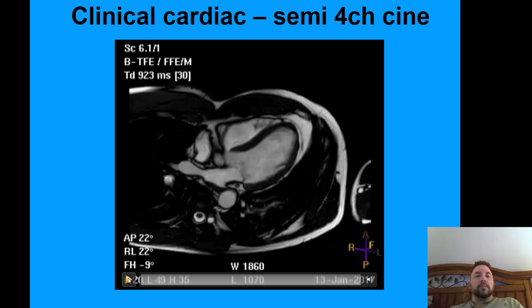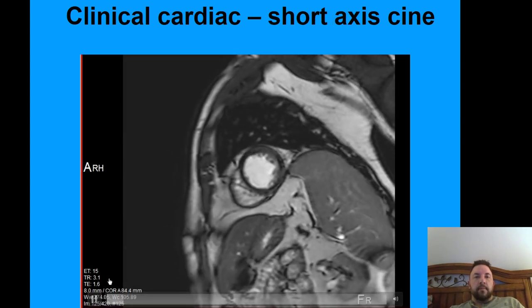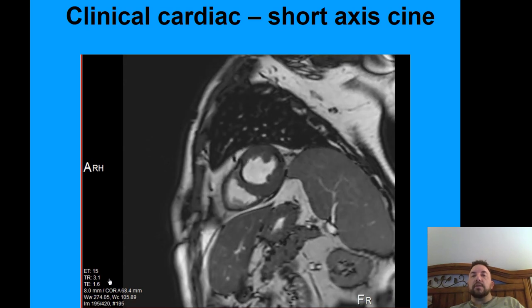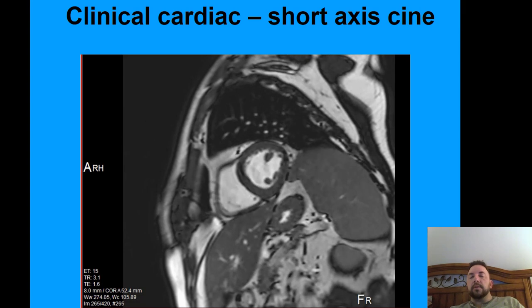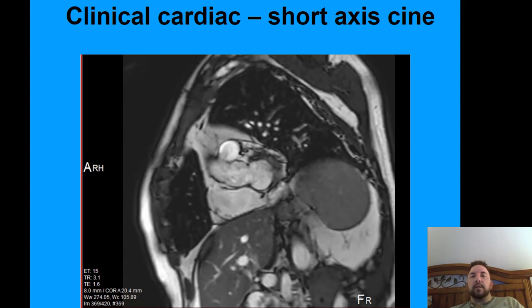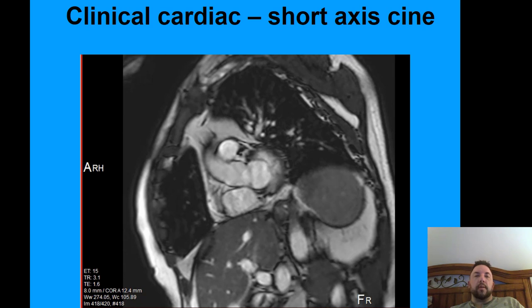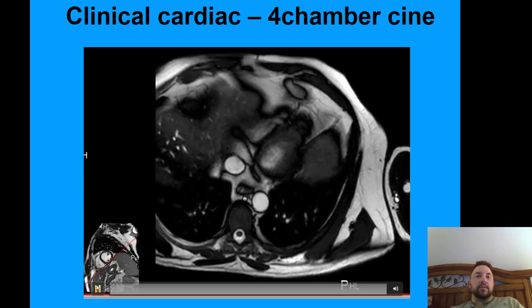So those cine images are going to be acquired within an entire cycle. And then you have multiple images acquired across these phases so you can see the heart in actual motion. And really that's the whole point and purpose of why it's so important for us to have the motion aspect. We need the rapid imaging. It has to be gated properly and appropriately, so that we can see the functionality within that acquisition.